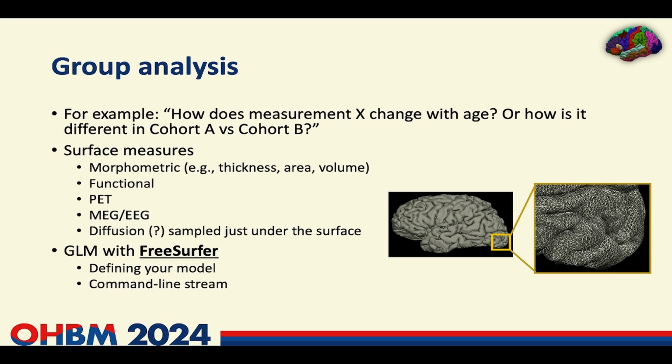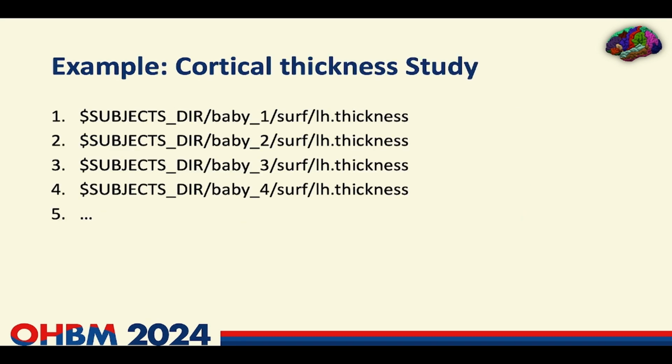And then we use a GLM with FreeSurfer, generalized linear model, and I'm going to show you how to define the model and how you can run 3 commands and basically do the analysis.